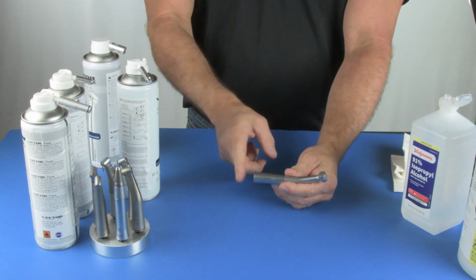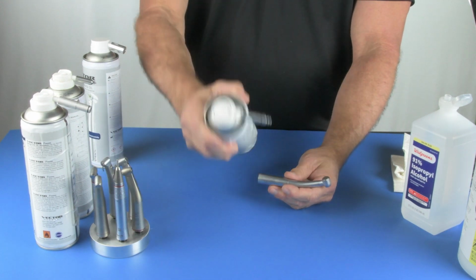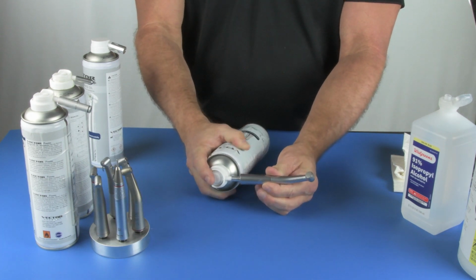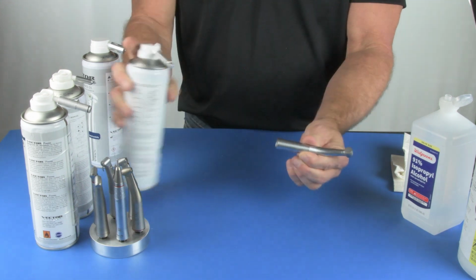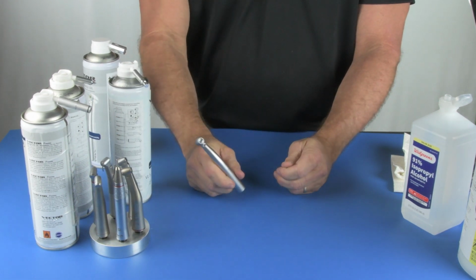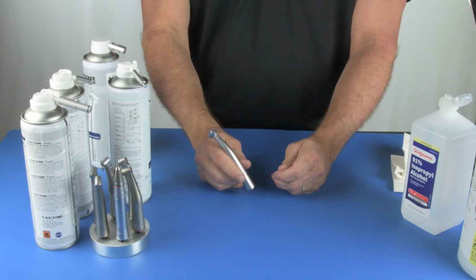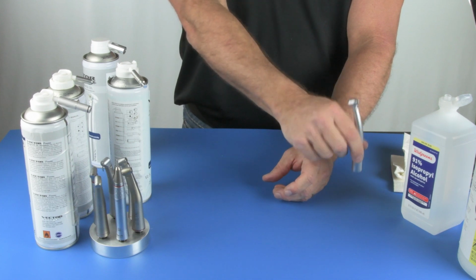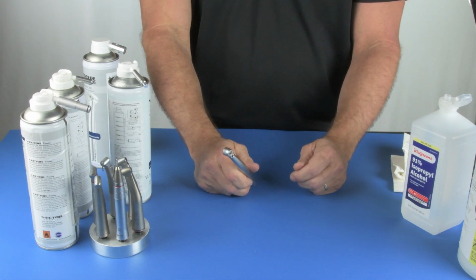These type of quick disconnect handpieces are all lubricated basically the same way. Find the right adapter for the handpiece, put the handpiece all the way snug onto it, spray 2 seconds, 1, 2. Remove the handpiece. On the high-speed handpieces, you need to blow out the excess oil. So either take it back to the operatory and run it for approximately 10 seconds, or put it on a quick blowout like a DCI device, which will run the handpiece just enough to blow out the excess oil.